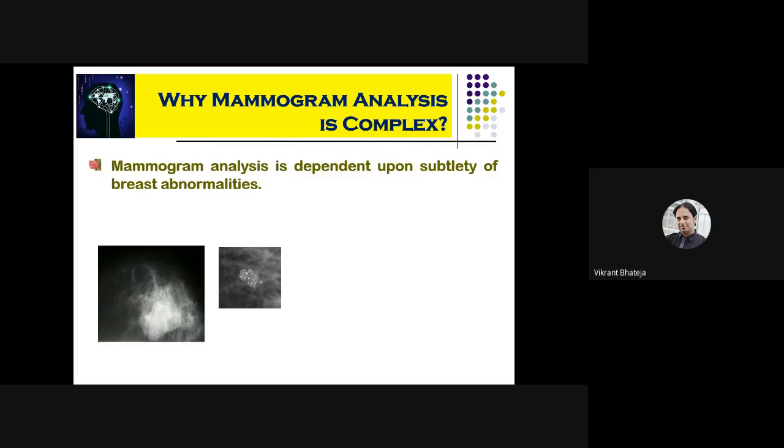Now, this is not yet over, because there is another type of mammographic anomaly, which is smaller in visualization. If you look very finely, there are some small dots present in this area. These small white dots are basically calcium dots accumulating in that region.